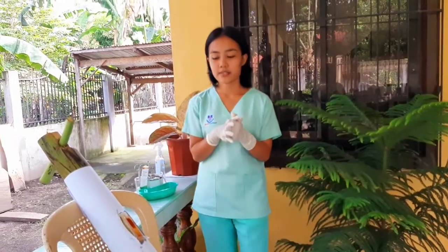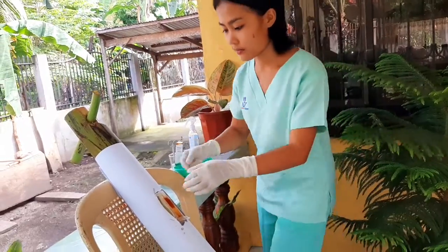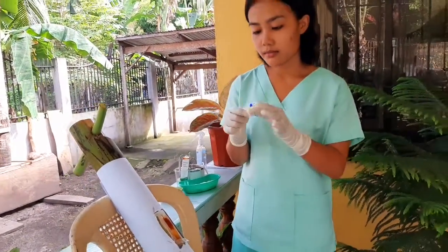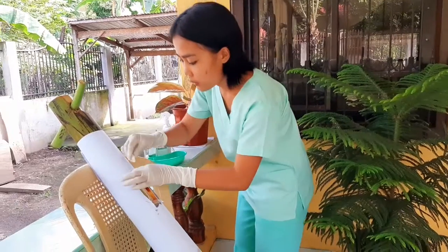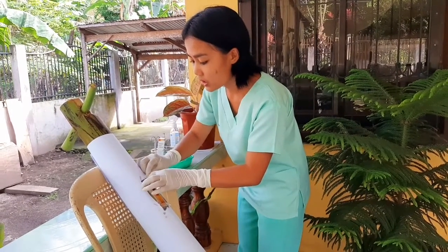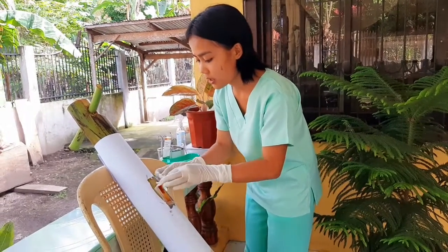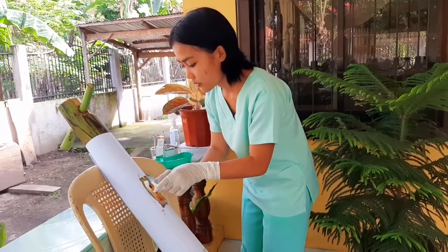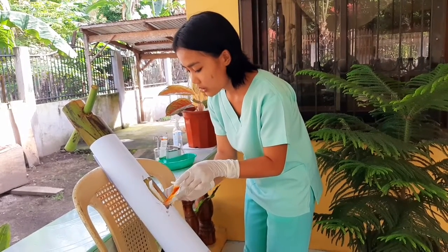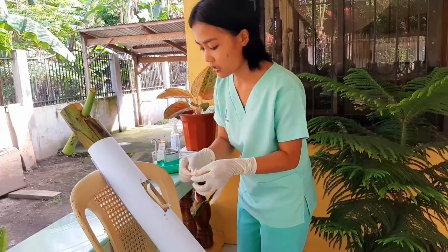And then I'm going to remove the tape, the bandage, or the ties. I have here a wet cotton ball. I will use it in removing the tape so that the patient will not feel pain on the skin when the plaster is removed. There is a possibility that the tape sticks to the skin, and the skin is thin over the bone, so it hurts when pulled.